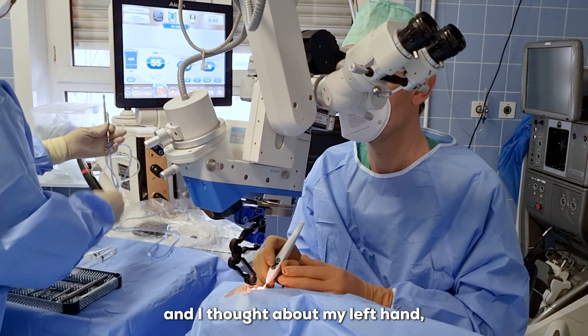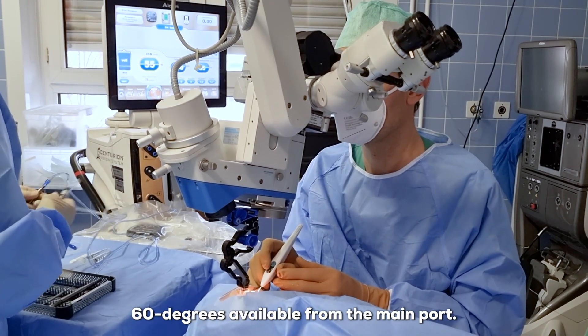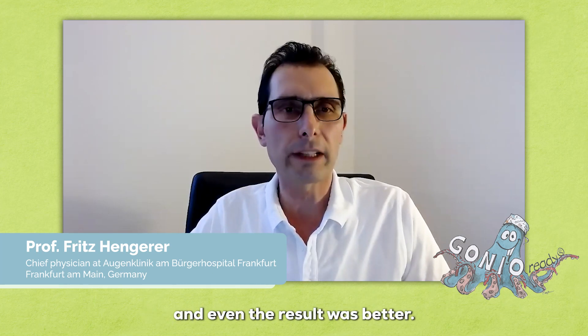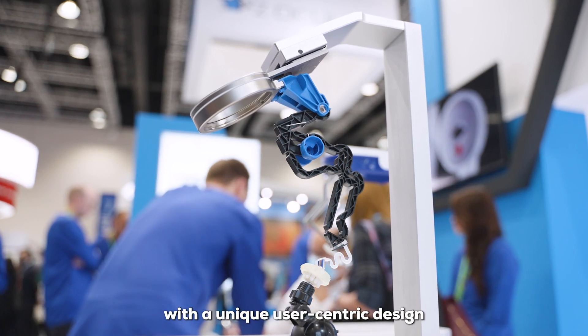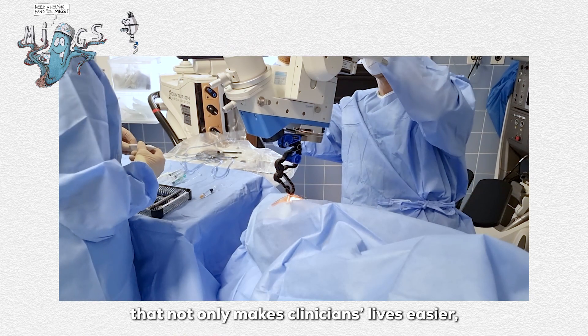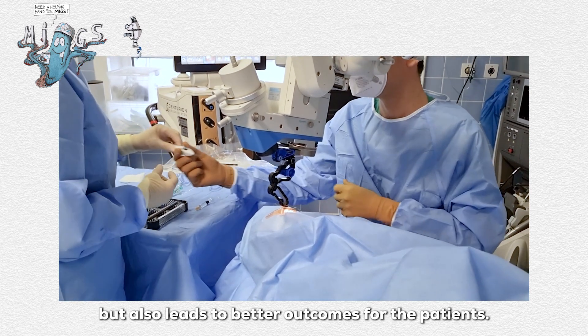When I first used it and had my left hand free, I found it better to have a side port incision 60 degrees available from the main port, so I could use a second instrument to stabilize the eye — and the results were even better. It's clear that the GONIO Ready was made with a unique user-centric design to alleviate the struggles MIG surgeons face, a novel solution that makes clinicians' lives easier and leads to better outcomes for patients.